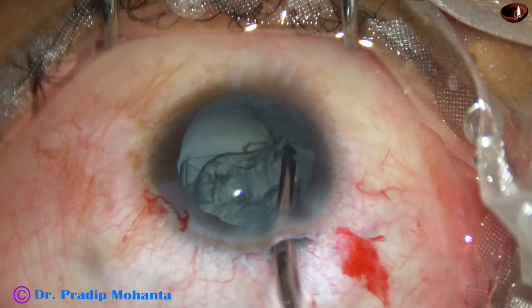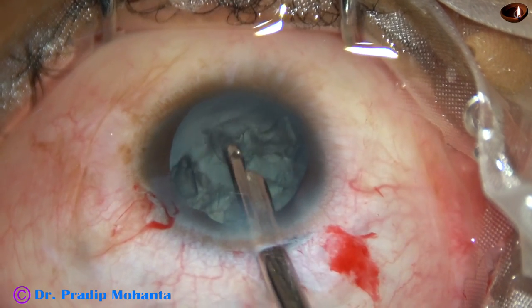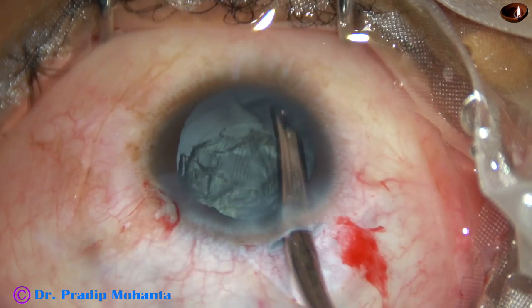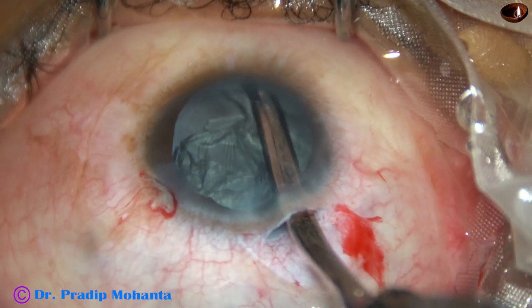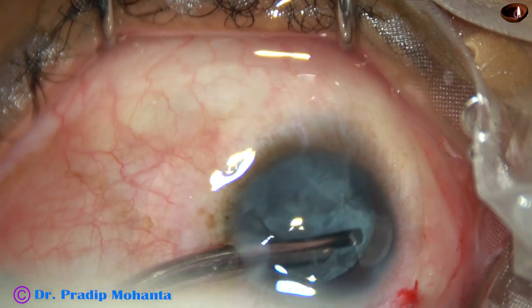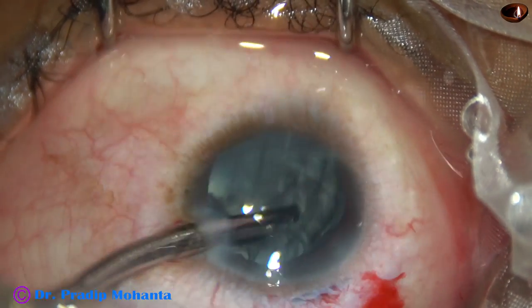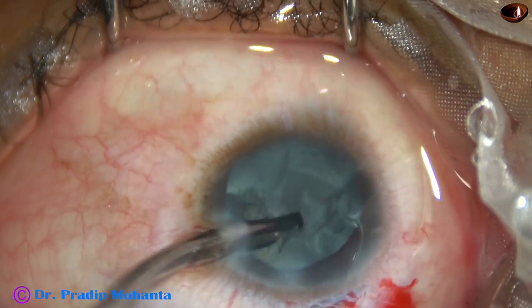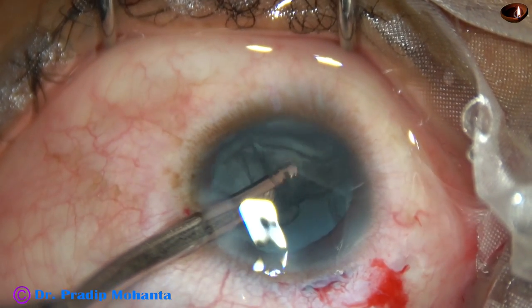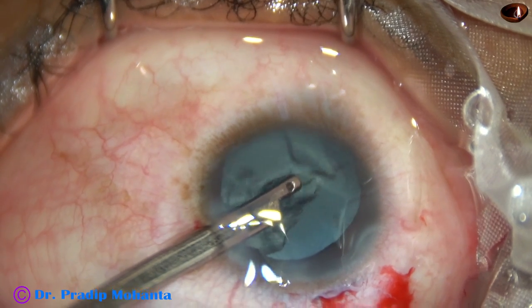But as soon as the anterior chamber becomes shallow, I will immediately come out, inject some more visco, and aspirate the cortex. The cortex is coming out slowly. I am aspirating the cortex, going through the side port and aspirating the cortex from 10 o'clock. The anterior chamber is remaining formed when I am going through the side port because the side port is snugly fit to the Simcoe.